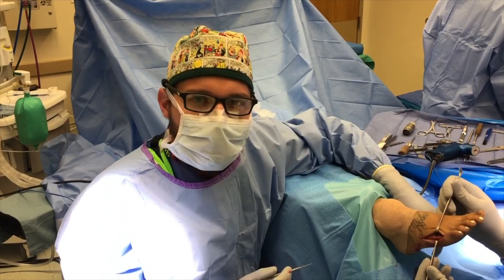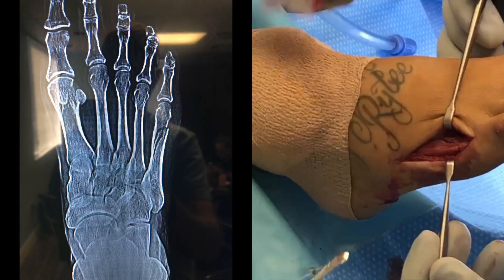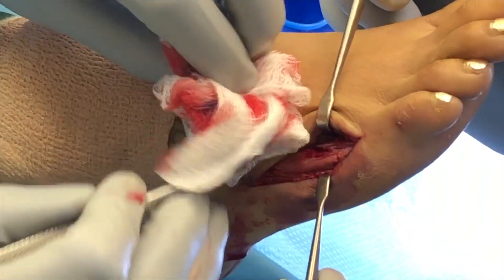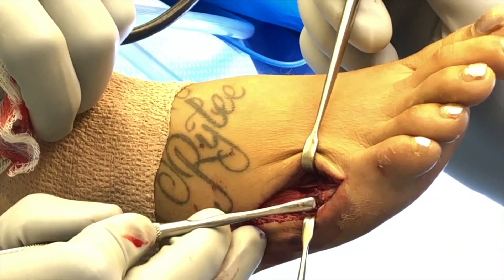We're in the OR now fixing that fracture we talked about earlier. We're going to zoom in on the foot and I'm going to actually show you the fracture line across this bone. You can see where it's bleeding here right at the tip of the instrument — that's actually the fracture line.